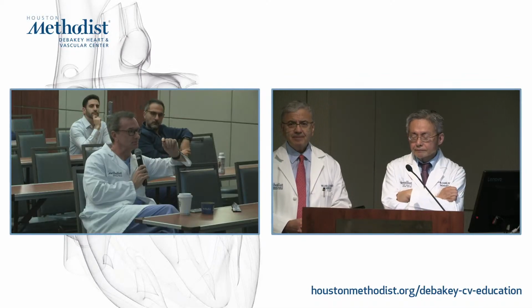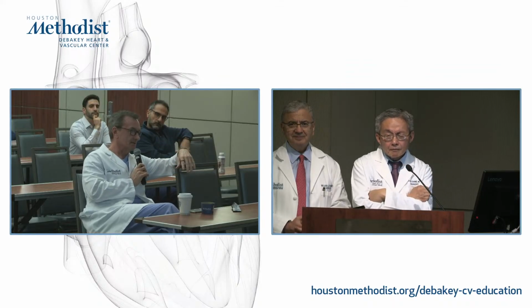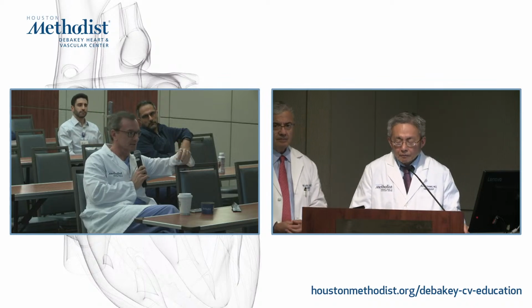So the comment is you made a very nice and consistent point about gaps on CT and requiring evidence of flow before you really talk about the clinical significance of it. And you and I have seen many cases, particularly with PVL, where CTs looked to have a significant gap, only to have a very thorough Doppler evaluation with no leak. So I think your approach that mandating flow is critical. We've had cases where ASDs, native AR, prosthetic valve, paravalvular have been called leaks without evidence of flow. I think that's a critically important point that you made.